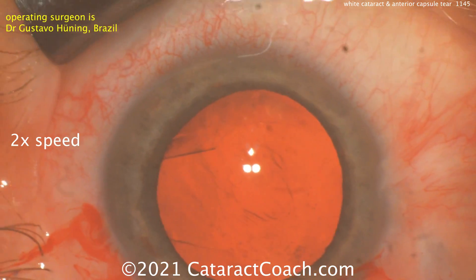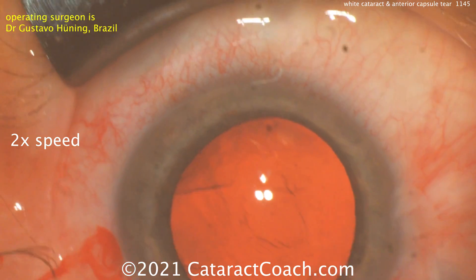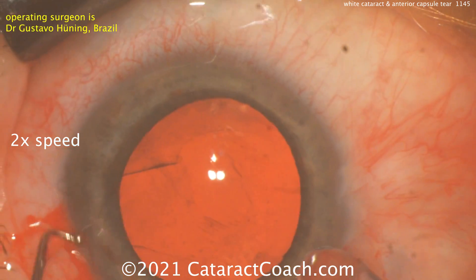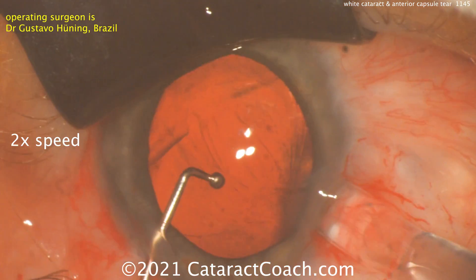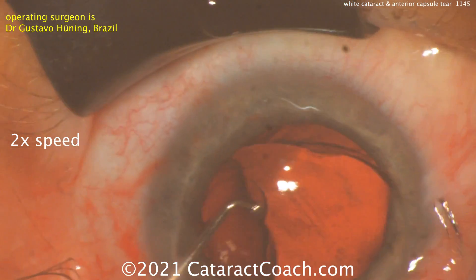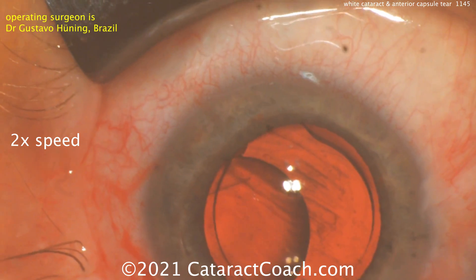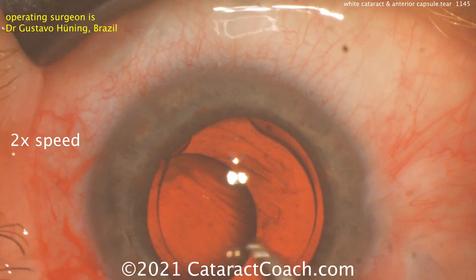Loading up the lens — what are your options here? You can still put the lens in the capsule bag; orient the haptics 90 degrees away from that run-out area. The lens is already loaded up. We want to be gentle — let it gently slide into the bag and don't push too hard on the posterior capsule. Here comes the lens, looks like a single-piece acrylic lens, going into the capsule bag and positioned quite nicely. The haptics are 90 degrees away from the area of the anterior capsule run-out, so that's going to be good.